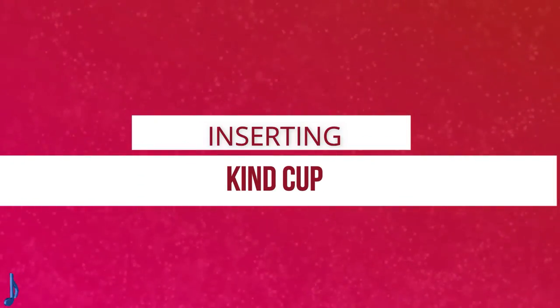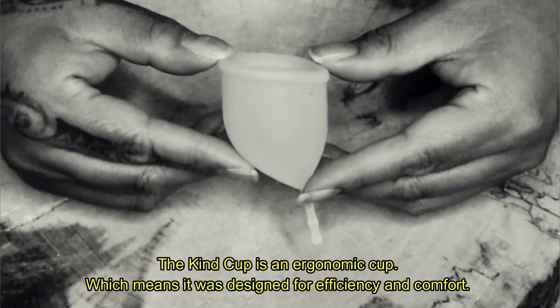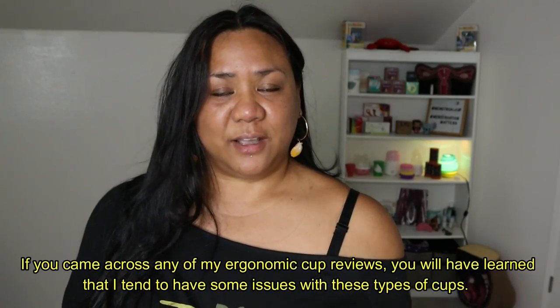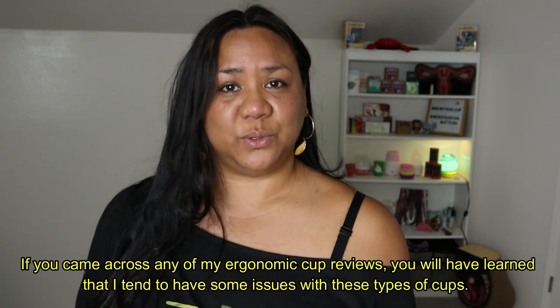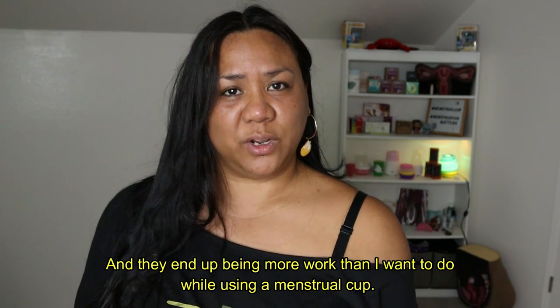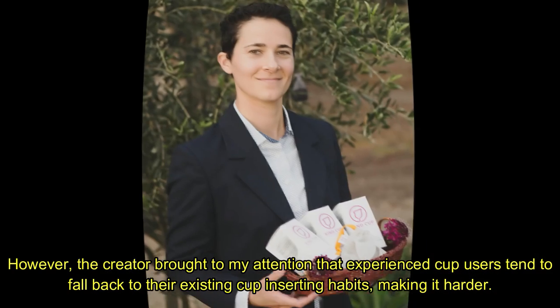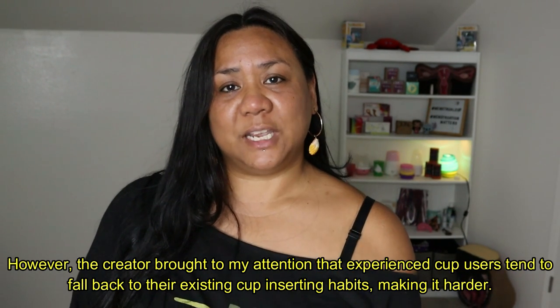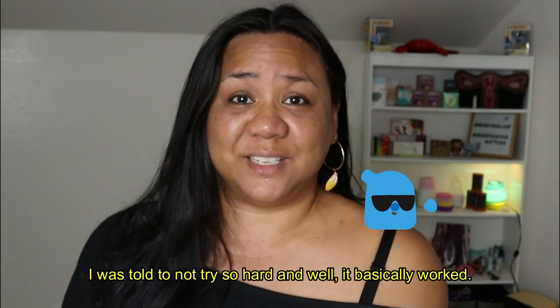Inserting the Kind Cup. The Kind Cup is an ergonomic cup, which means it was designed for efficiency and comfort. If you've come across any of my ergonomic cup reviews, you'll have learned that I tend to have some issues with these types of cups and they end up being more work than I want. However, the creator brought to my attention that experienced cup users tend to fall back to their existing inserting habits, making it harder. I was told to not try so hard and well, it basically worked.